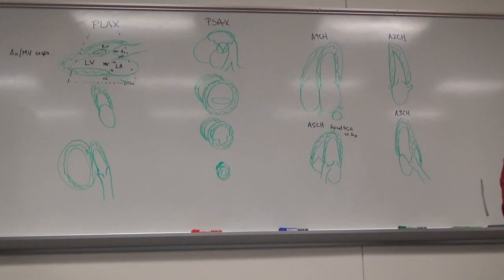So it tells you the anatomy that you should see on this. It tells you the transducer location, so this is going to be parasternal in this area, and it's going to tell you where the index marker should be pointing for every single view. So you want to print this document out and kind of go through it.